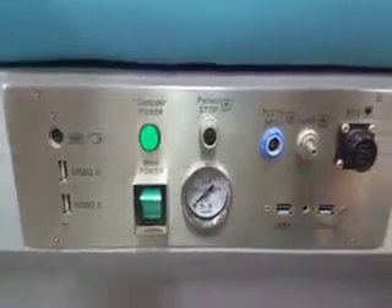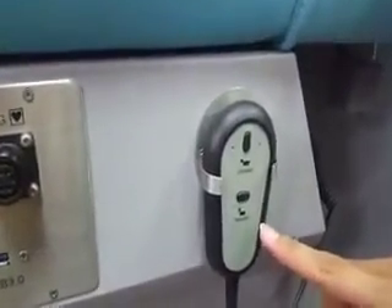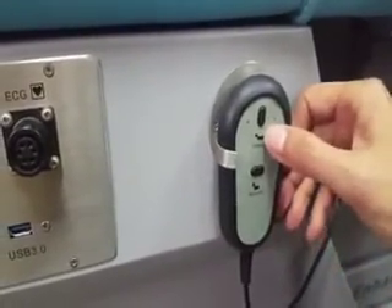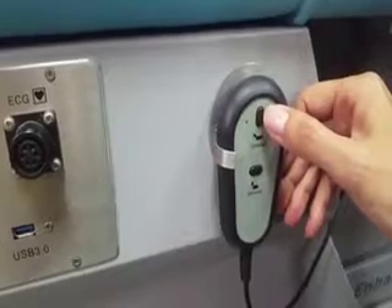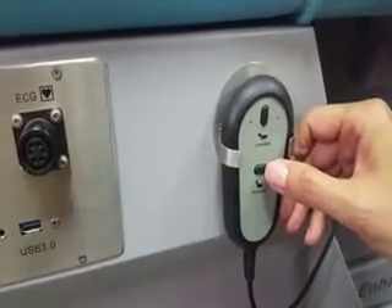Here, you will find the bed elevator remote. You can press the up button to lift the bed and the bottom button to descend the bed.